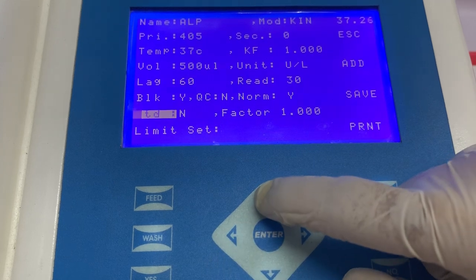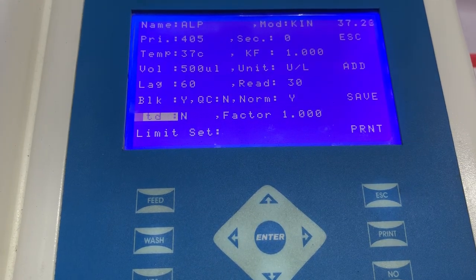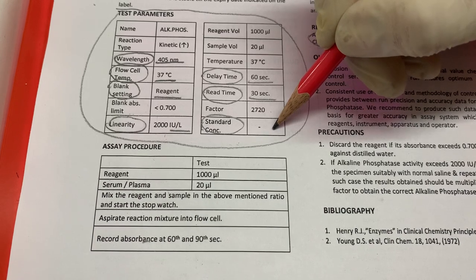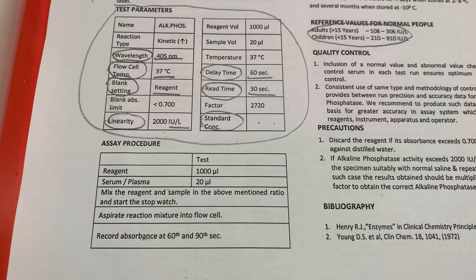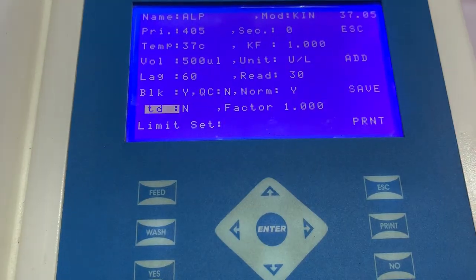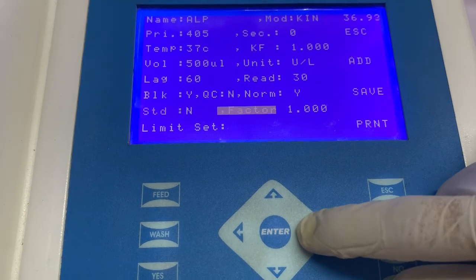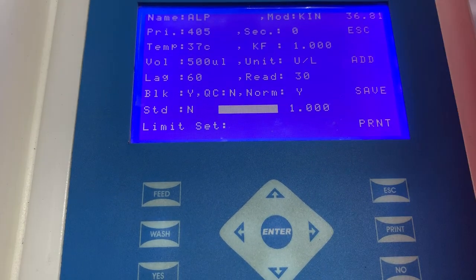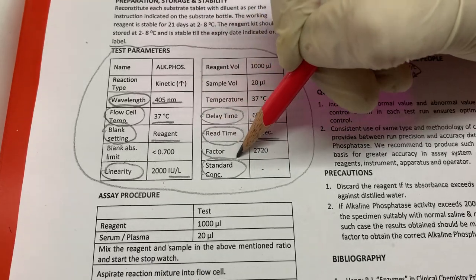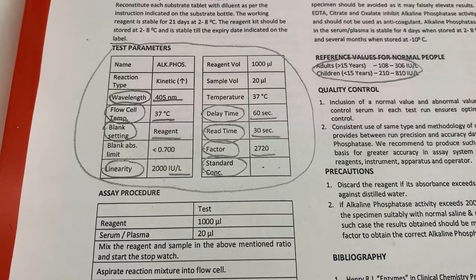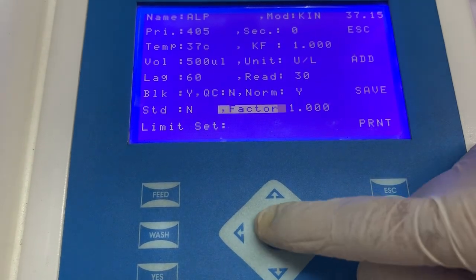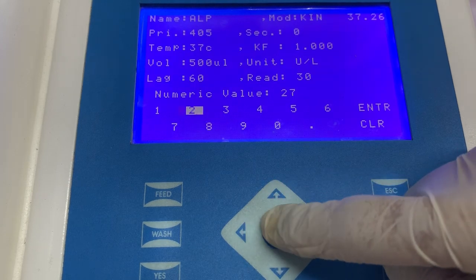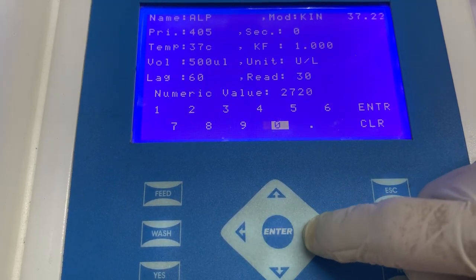The next information that needs to be added is of standard — whether the standard is available in the kit or not. Again, this information can be seen in the instructions for use, where the manufacturer clearly mentions whether the standard is available in the kit or not. In this case the standard is not available in the kit, so in the software we will keep the option of standard as no. The next information that needs to be added is of factor. The manufacturer clearly mentions what is the factor used for the calculation of the result. Select the option of factor, enter the numerical value seen in the instructions for use, and press enter.